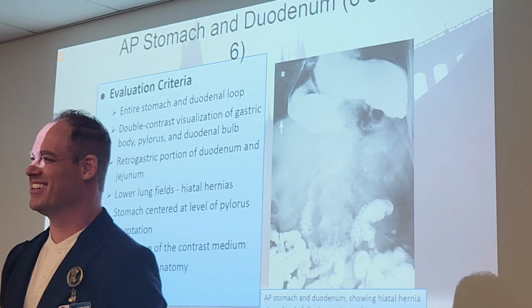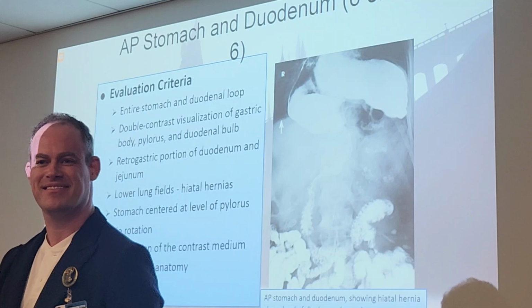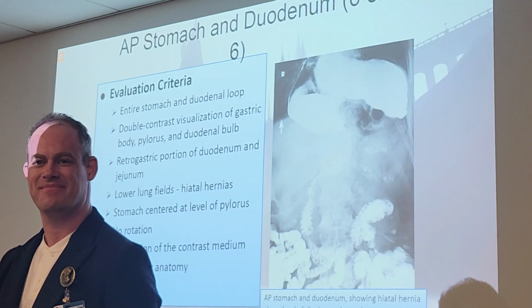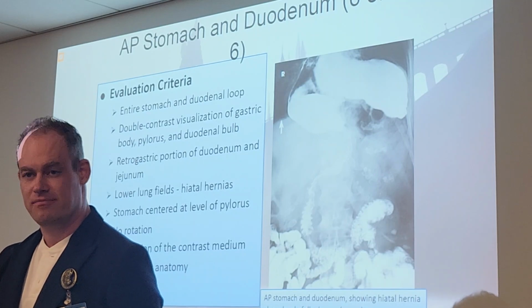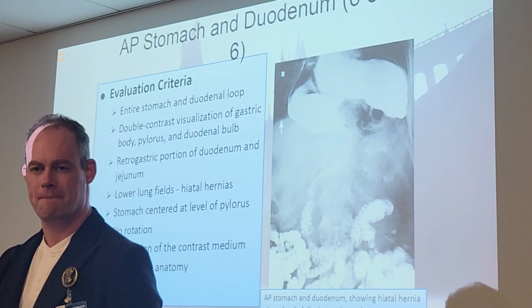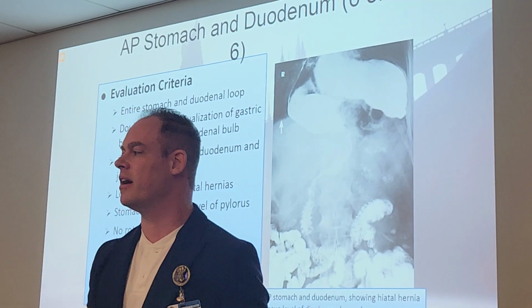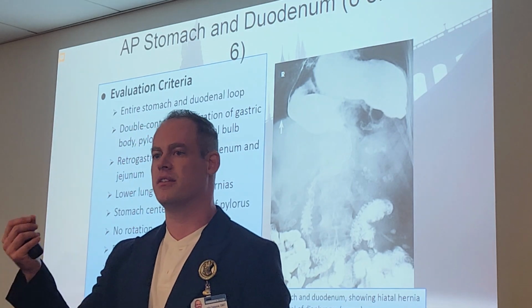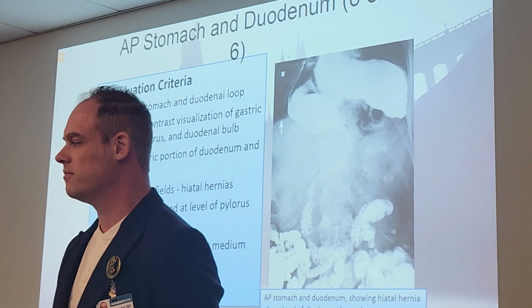So, question: for the first three that you mentioned, PA, RAO, and lateral, they're all the same. Okay, cool. Then LPO and then AP would be the last one. AP supine, barium in the fundus, air's in the body and pylorus. That's the five you need to know.